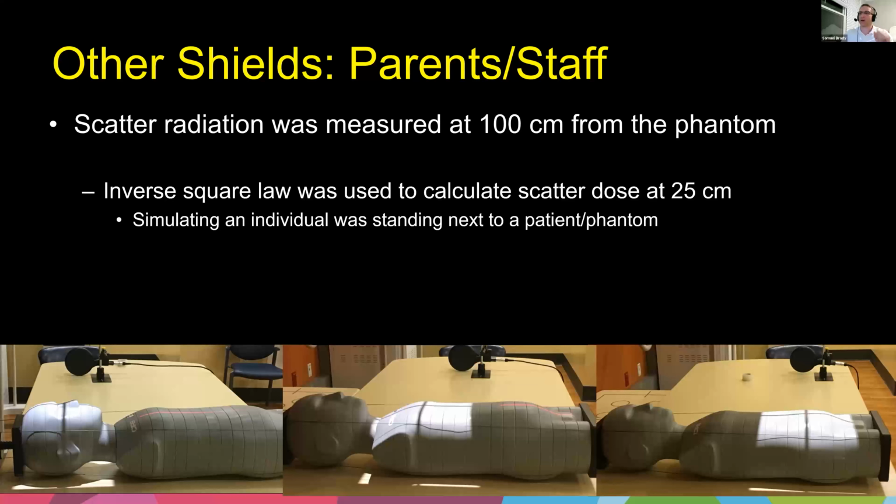I would say one comment about the collimators. There have been many times where I get a phone call and the technologist says the mom will not let us do an X-ray. I say, okay, let me talk to her. She says, I want my kid covered in lead. They quite literally want them head to toe covered in lead because they are afraid of radiation. I simply explain, you know what? We actually put all of the shielding in our machine, so we don't have to wear it.